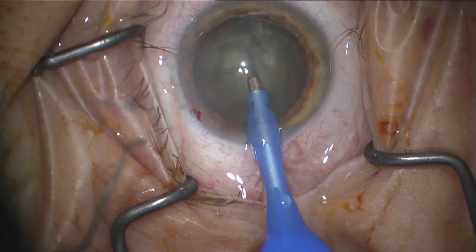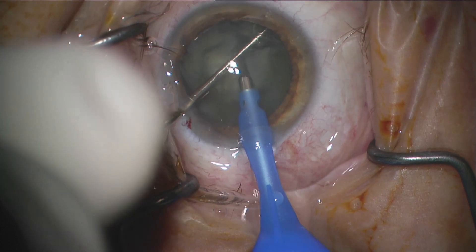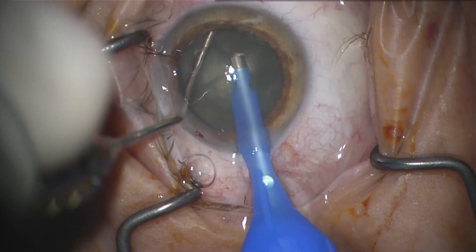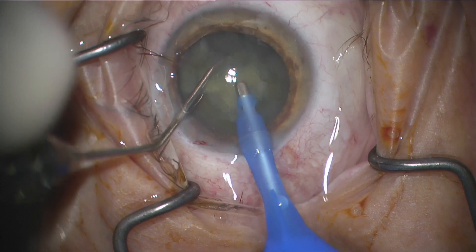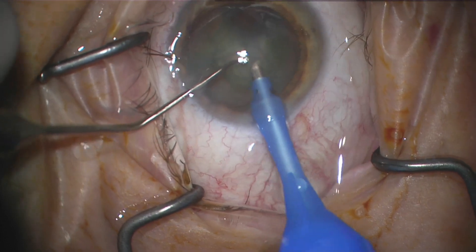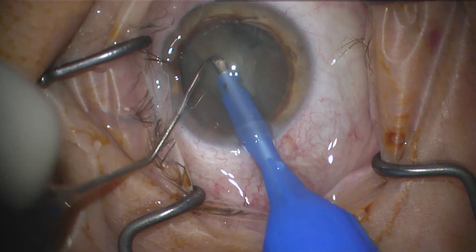The interesting thing is the fluid runs through a bag that's hanging and elevated at a height level. The fluid is released — your tech can unclip it — so the fluid will be actively running. There's no foot pedal to actually turn the fluid on and off, so your tech will have to manage that.